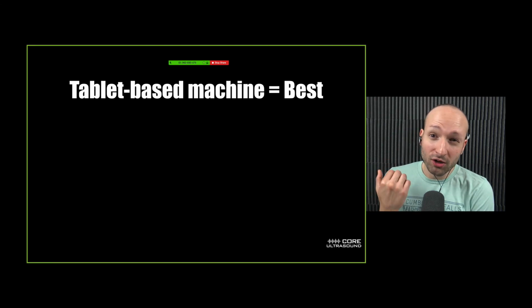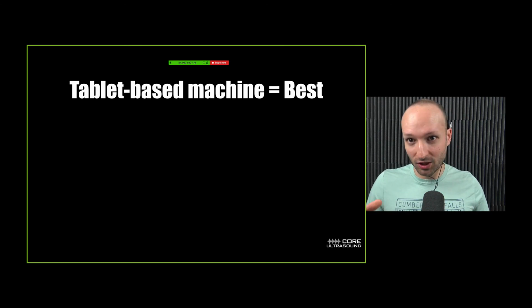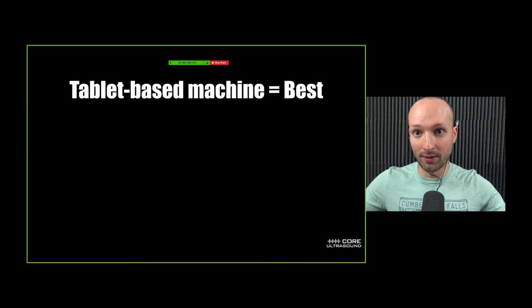Now, if you have a Butterfly or a Lumify, probably the best because it's really easy to clean. And in fact, I keep mentioning the website. I'm sorry, I just have my resources on my website already.